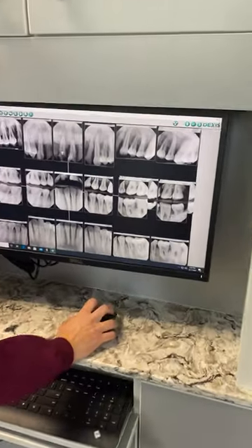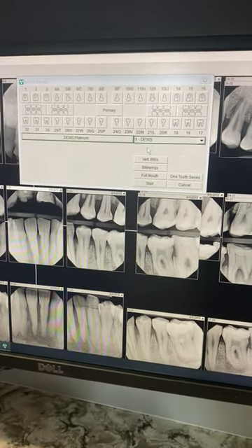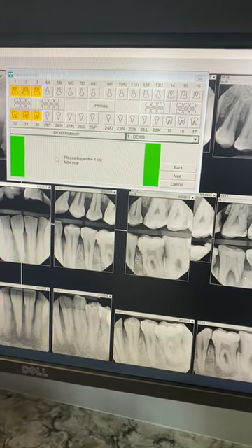Just like you've seen before, when you're in Dexis, you're going to go to what looks like a little pinwheel. We're going to click it, and down here we're going to click bite wings. Once this is lit up green, it says it's ready to go. That means you're good.